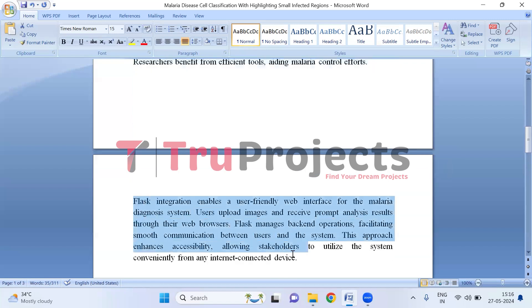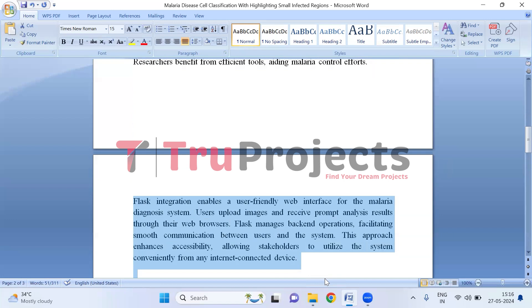The integration of Flask enables the creation of a web-based interface for the project. This interface allows users to interact with the malaria diagnosis system by uploading images and receiving analysis results in real time.